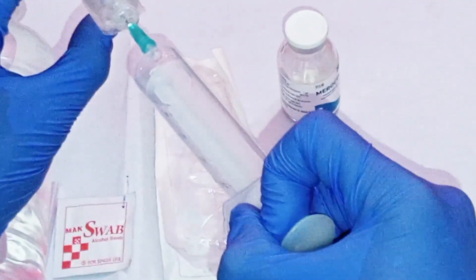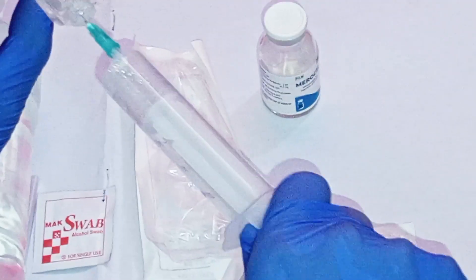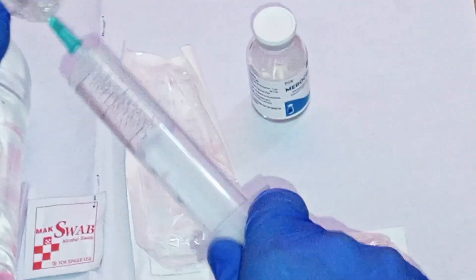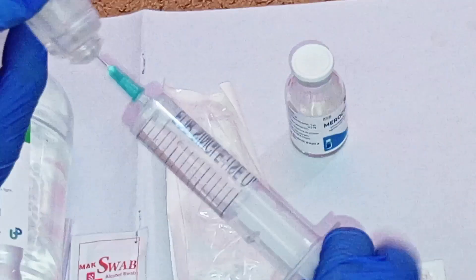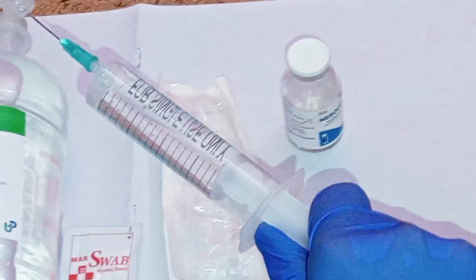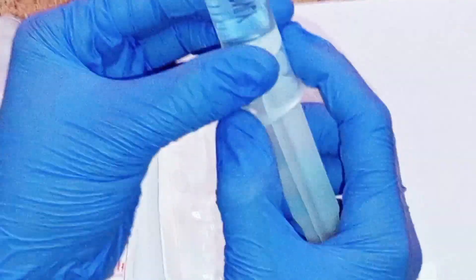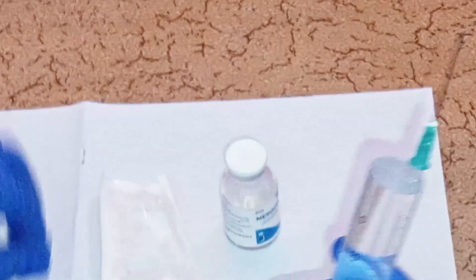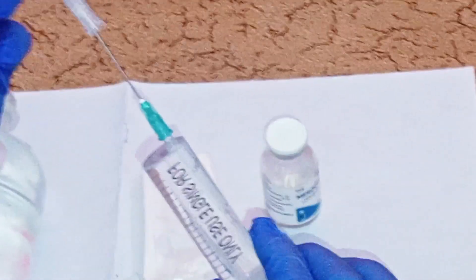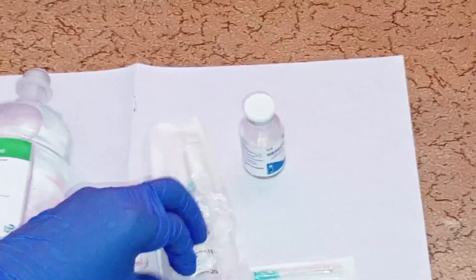Withdraw all the sterile water for injection into the syringe so that you can incorporate it into the meropenem vial. Draw all the sterile water from the plastic vial, then dispose of the plastic vial. Remove any air bubbles from the syringe, then replace the cap on the needle and place the syringe back into the packaging to avoid contamination.